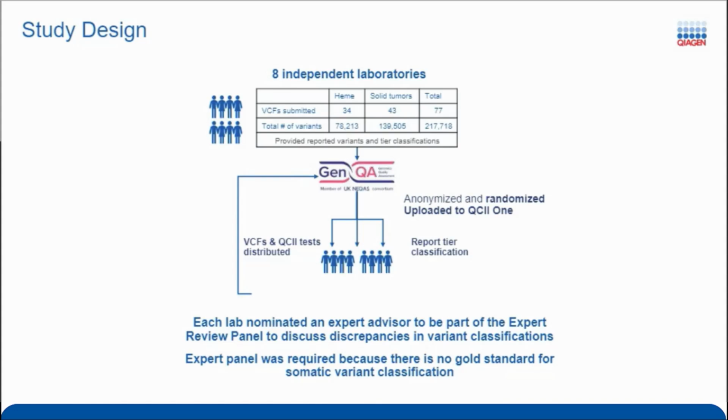If you go into the methods of the study, you'll see there were strict parameters applied to every sample that was uploaded. Everything had the same allele fraction cutoff and was in the same gene list. The software would take a VCF, and filtering was applied to what was in it. Those filters were set across the board.